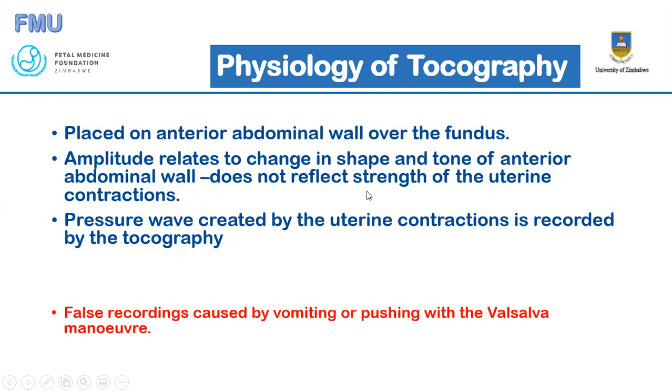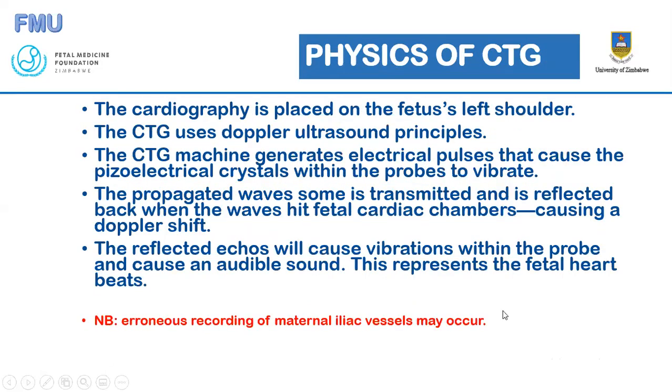So it should be placed at the fundus, not anywhere else. Of course, false recordings may occur with the woman vomiting or having a Valsalva maneuver for one reason or another. Then the physics of the CTG. What does the CTG do?